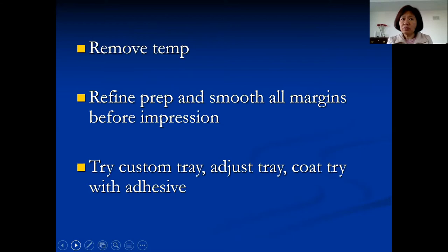When you first see the patient, you remove the temporary. Sometimes you need to refine the prep and smooth all the margins before the impression. You also need to try the custom tray, adjust the tray, and coat it with adhesive before you start. Put that aside — when you're ready for the impression, the tray adhesive will already be set and you won't have to wait.